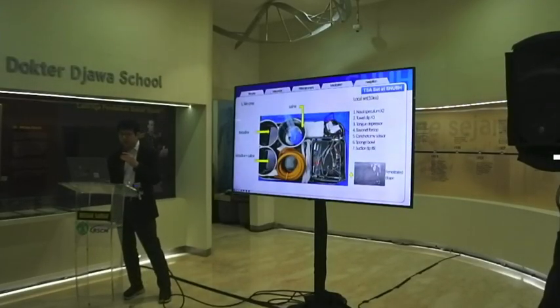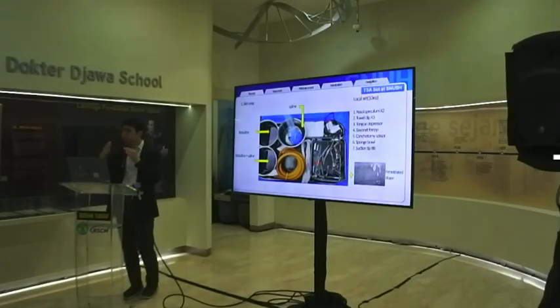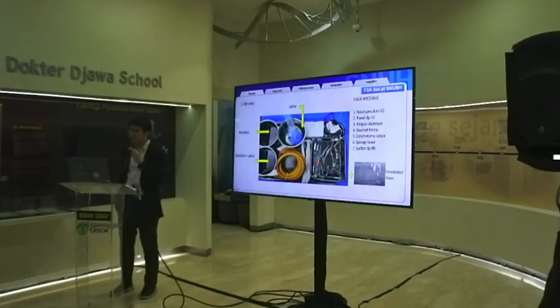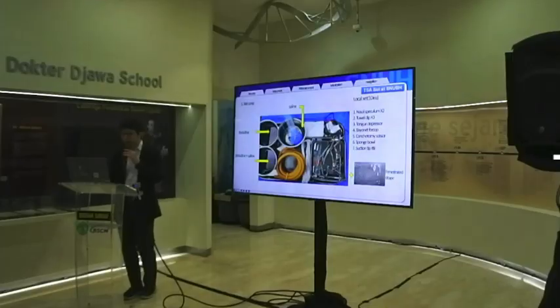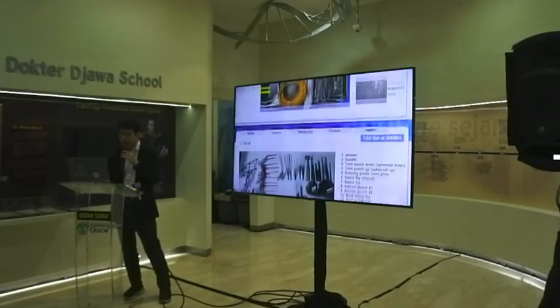And this slide is the explanation of all these surgical instruments one by one, to educate my scrub nurse. Some instruments maybe are not available in Indonesia, and some are available. So it is not always essential or mandatory, but I will share this slide with you, so you can get used to these instruments.